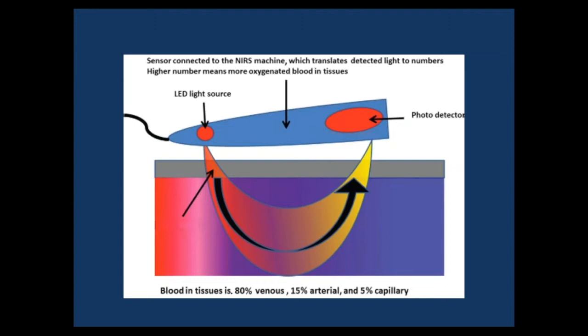And the mixed venous blood, if you are able to get it invasively, you need to get a sample from the pulmonary artery, which is really difficult and almost impossible in neonates. In adults, and in some neonates, we still rely on a pulmonary artery catheter to get the mixed venous blood sample and correlate that with the arterial sample and get an impression about blood flow or the oxygen consumption.